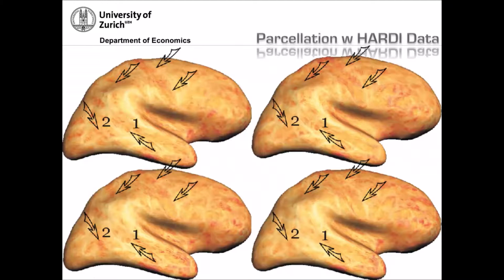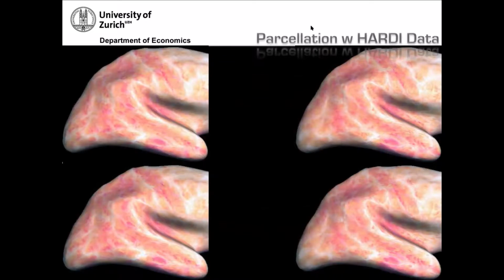For a long time, or I guess still, it's true that the diffusion is considered much more isotropic in cortex, but what we found was that even though it's isotropic, it's not perfectly spherical. There is some jaggedness to the 3D diffusion profile, and that is very reproducible. Here is just another example.